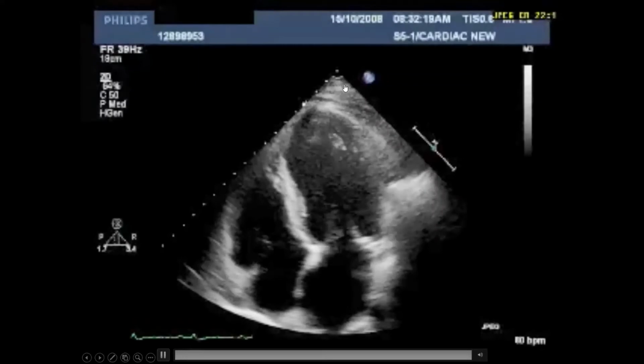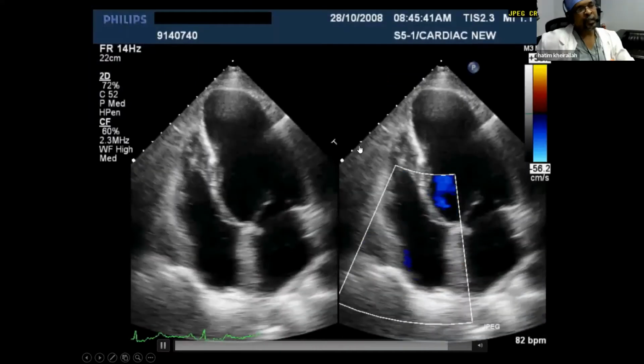Okay. Thank you, Dr. Hatim. Now, what do you see here?